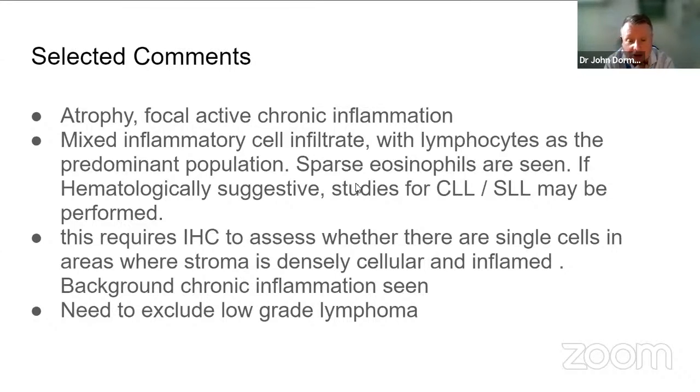That ductocentric type of inflammation that's quite mixed is usually more reactive rather than a lymphoproliferative disorder, which isn't usually ductocentric, is throughout the cores and can wipe out the glands. But there's a couple of people who wanted to exclude low-grade lymphoma, which probably relates to the ones who wanted to do immunohistochemistry.